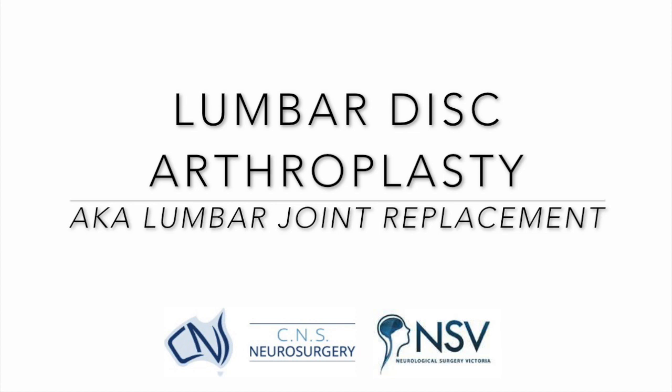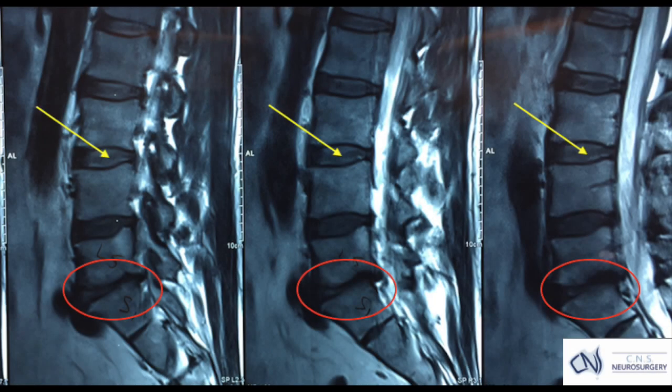This brief video is on artificial disc placement in the lumbar spine. Lumbar spinal discs can be quite degenerate, as you can see in the red circle area, compared to the more normal looking disc which is marked by the yellow arrow.